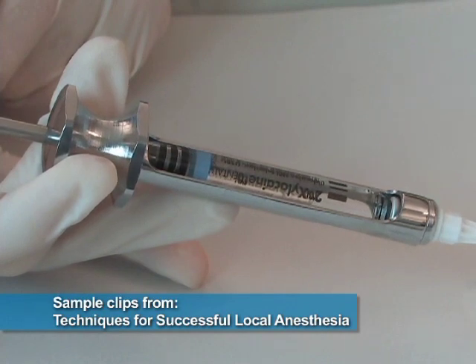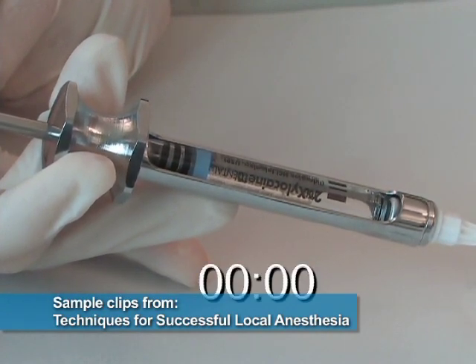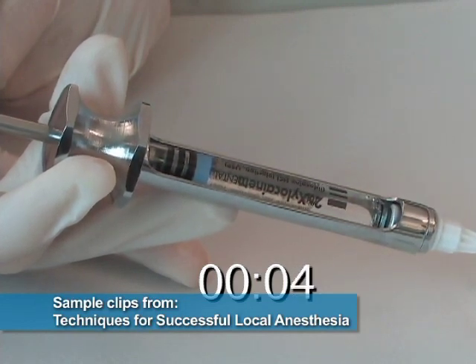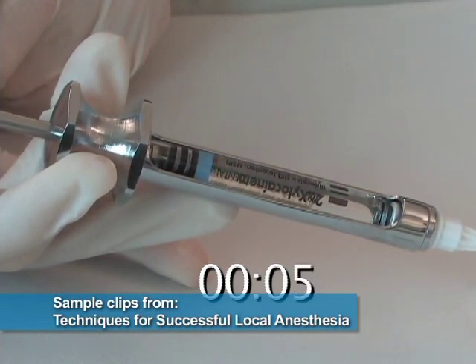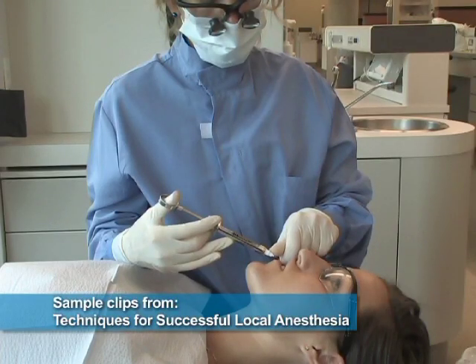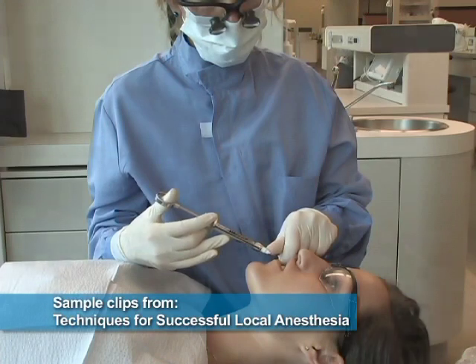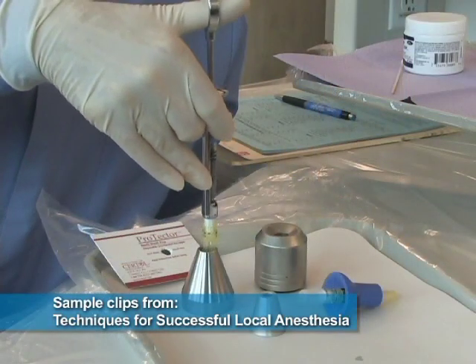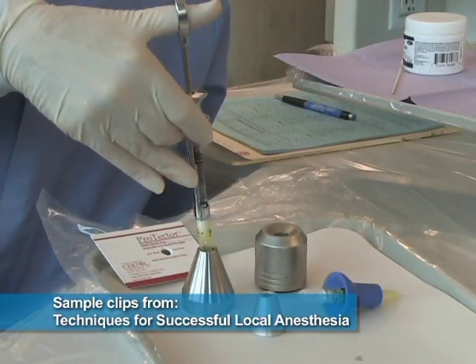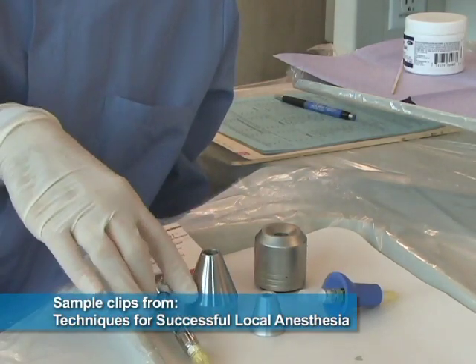Here is an example of an appropriate deposition rate. Finally, withdraw the needle slowly from the tissue and make the needle safe using an accepted recapping technique. A variety of commercial needle guards are available for healthcare professionals.